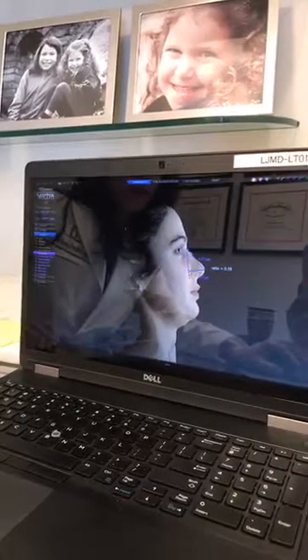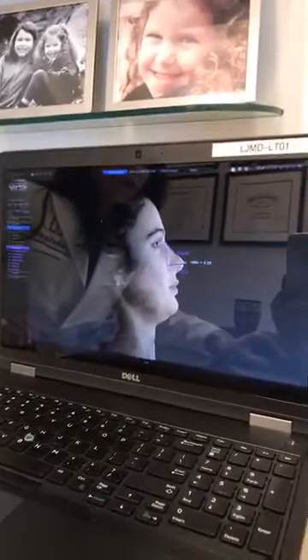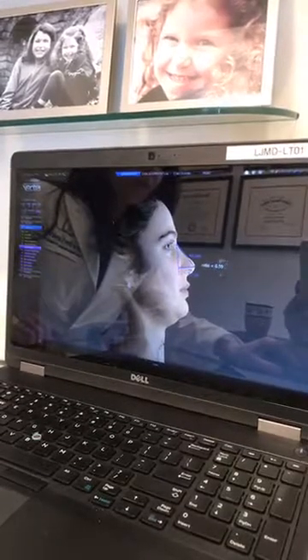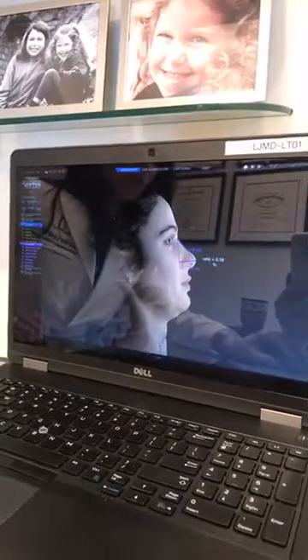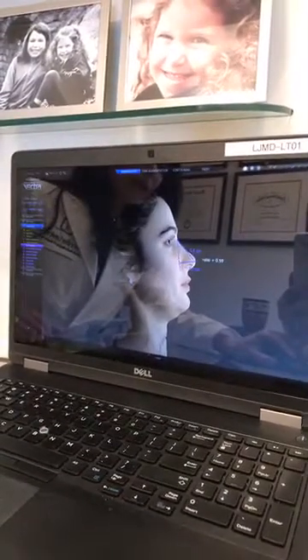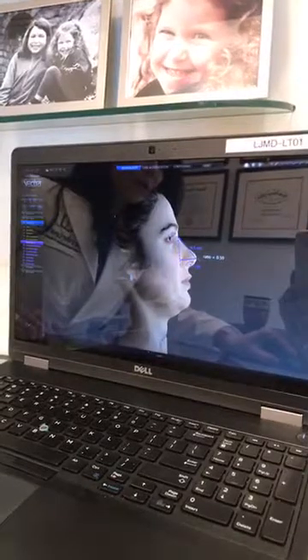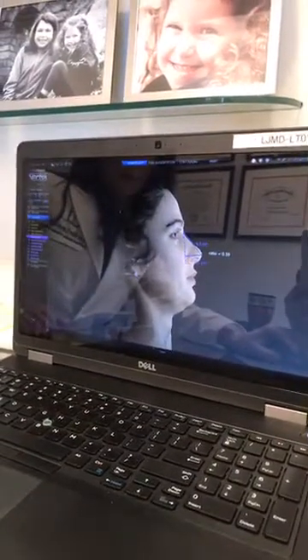Then when we're looking at the relationship between the dorsum and the tip projection, this should be like a 3, 4, 5 triangle, and that ratio is about 0.6. Again, Kristen's pretty close here. If we look at the topography, or how the dorsum is, she's slightly low at the very top of her dorsum, or bridge of her nose, and she's a little bit too high here closer to the tip.